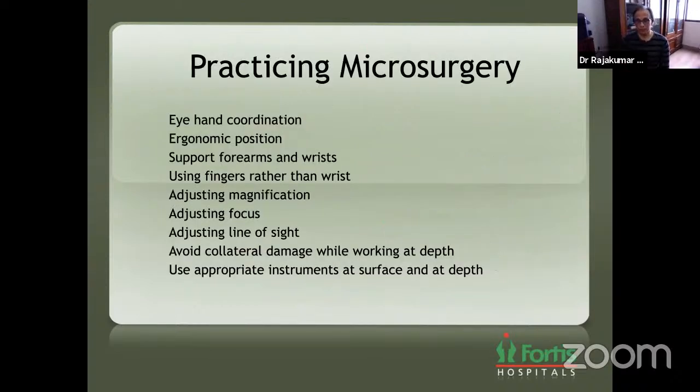So how do you practice microsurgery? This is not a big teaching class for microsurgery, so I'm not going to teach all the steps. But the first thing you have to have is eye-hand coordination. Surgeons who have never used a microscope, suddenly you start using the microscope, you find that they do not move as well.